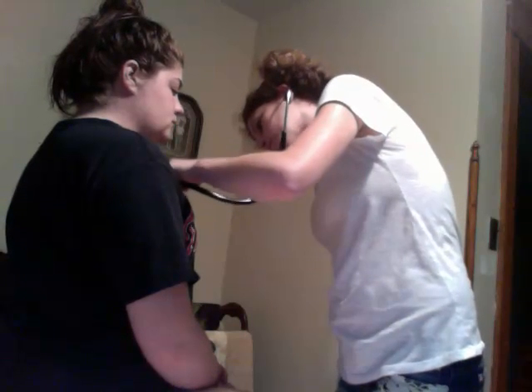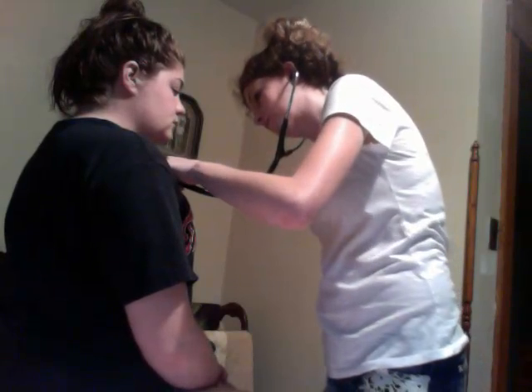And her heart rate is regular, and it's a good rate and rhythm. No murmurs. All right. Then with the diaphragm of the stethoscope, I would study heart sounds from the apex up to the base, or vice versa. So I'd use this part. Okay. And now we're done with the heart part.